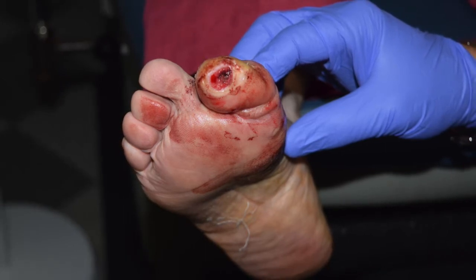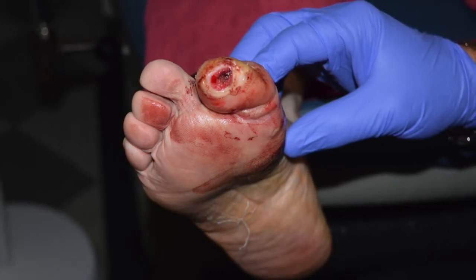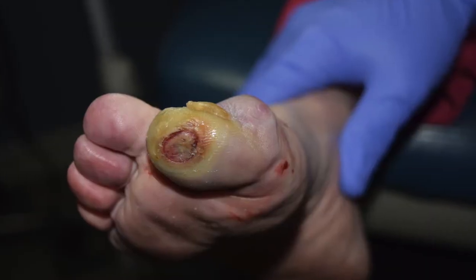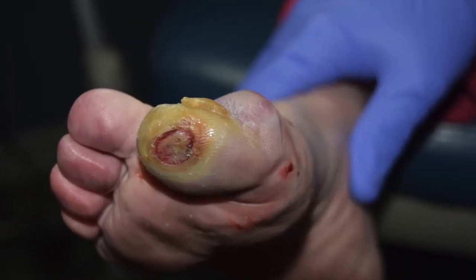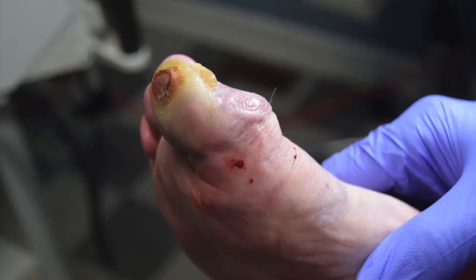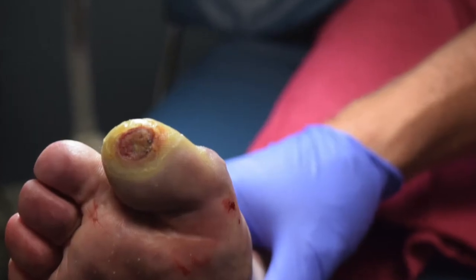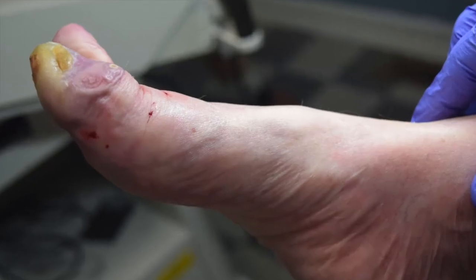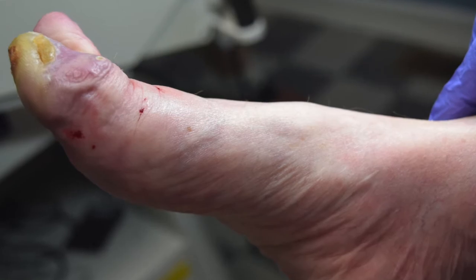You can see the ulceration and how significant it is when we first looked at her. This is actually a week before the surgical procedure. This is how it looked when she presented to us — a pretty chronic infection. You can see a lot of undermining of the ulceration here. We did local anesthetic on her and in the office corrected this using minimally invasive surgery.